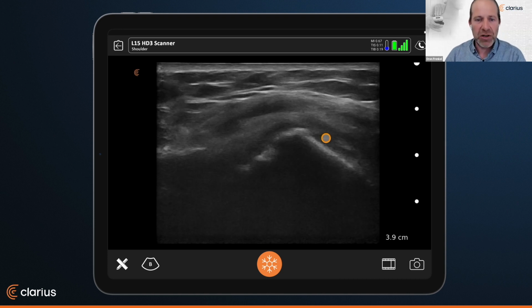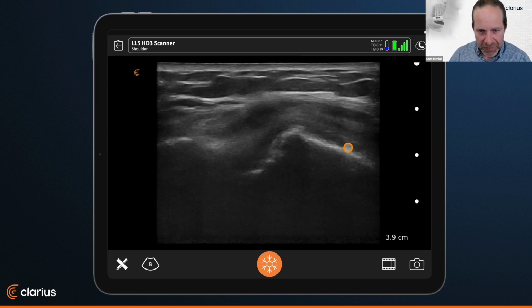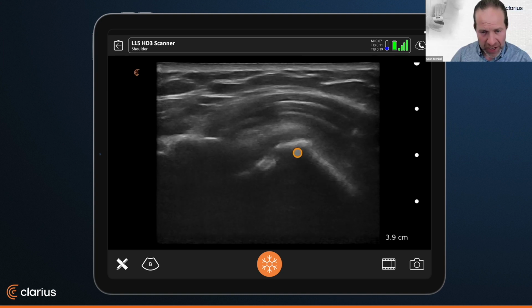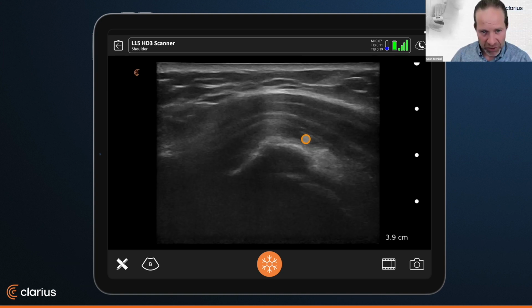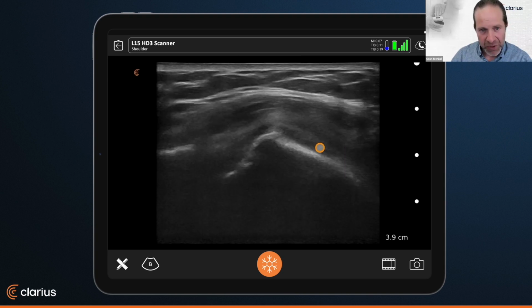It's a really short clip. It's hard to really assess the full depth. Yeah. But you can watch as it replays. The person is trying to abduct their shoulder, and they just can't get the humeral head deep underneath. The acromion is getting stuck there in real time.